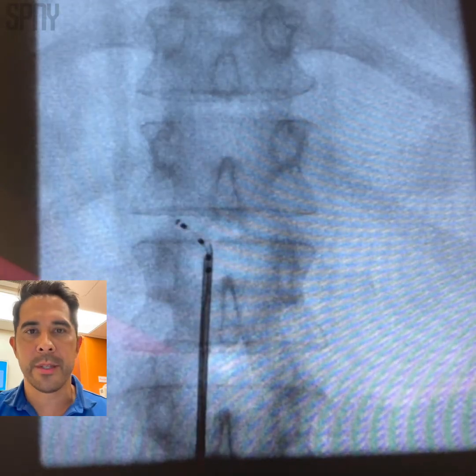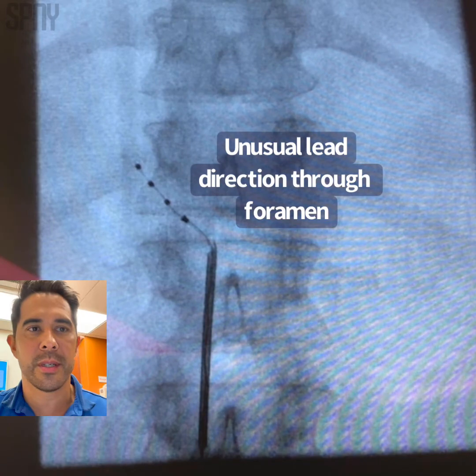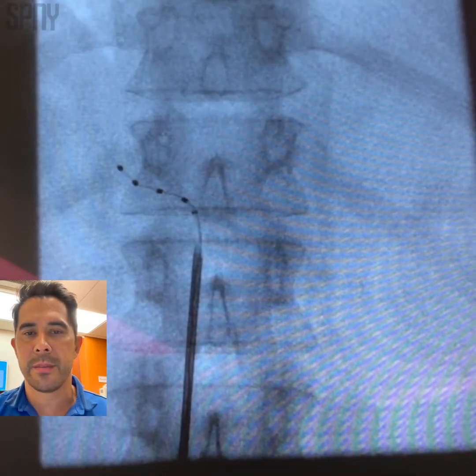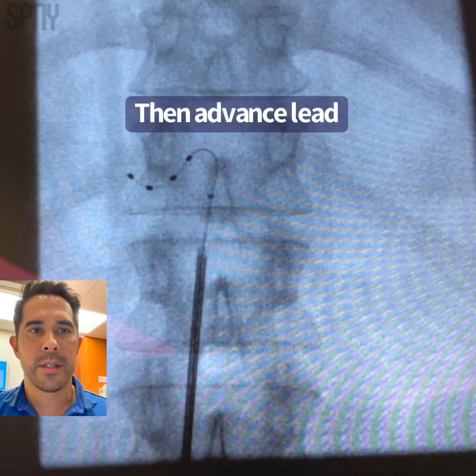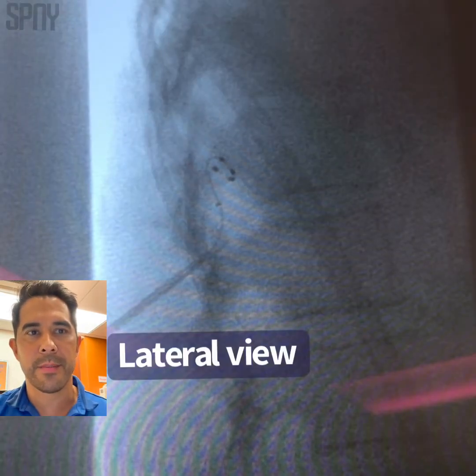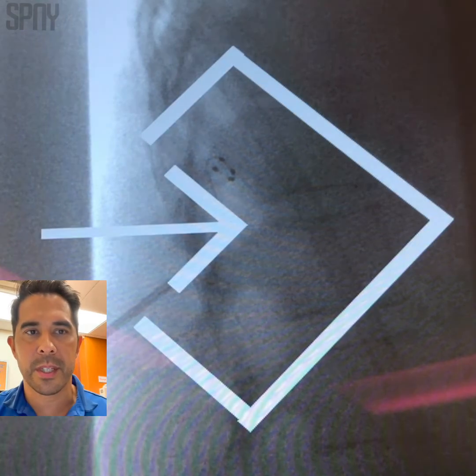Now we go lower in the foramen just to not go through the same obstructed path we were on. You can see the lead took a funny angle, but I'm just trying to save it here by pulling it back into place. And you can see by pushing the lead forward, we were able to do that. In the lateral view, we're at the top of the foramen, hugging it with two leads under the pedicle — so we're satisfied with this placement.